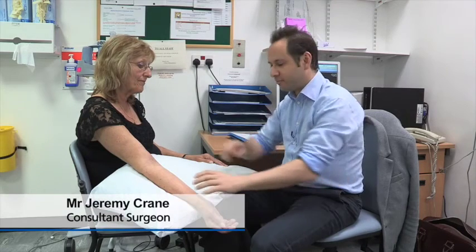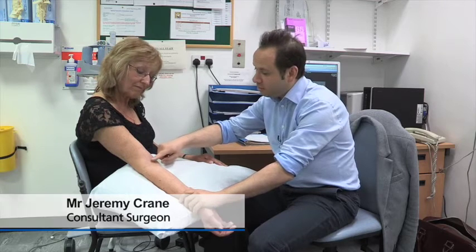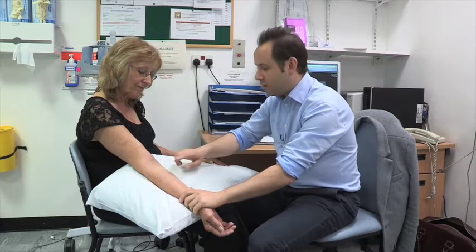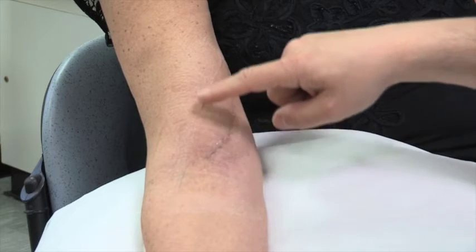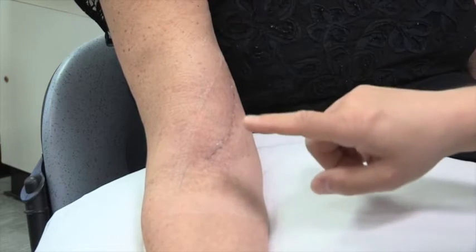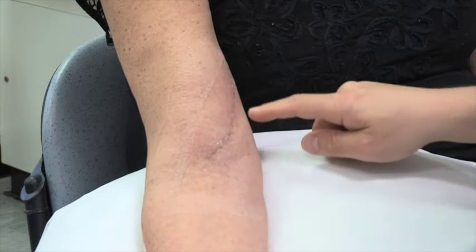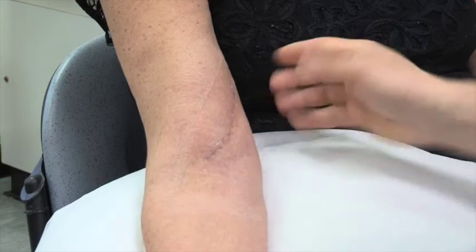What Valerie had was a slightly more complex fistula operation. You can see on the arm here that normally the straightforward fistula comes up the arm — it's a one-stop operation. However, with Valerie, she didn't have a good vein that traverses the arm this way. But she had a vein called the basilic vein that lies hidden along the inside of the arm underneath the biceps muscle. You'll see there's a scar here which is healing very nicely.